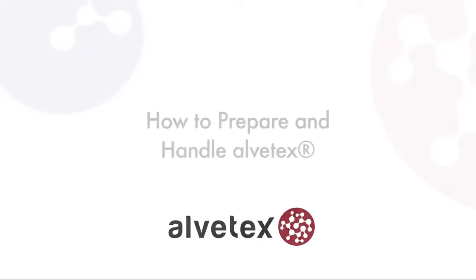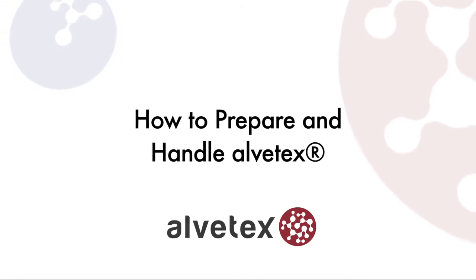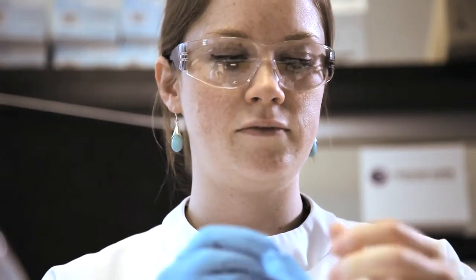Once you've chosen which Alvatex product to use, you'll need to prepare the Alvatex membrane for cell seeding. This is a simple three-step process. All procedures involving the handling of Alvatex should be performed wearing gloves, according to standard aseptic methods.